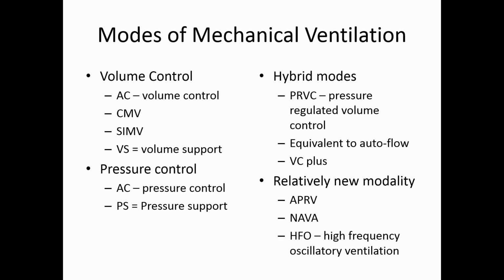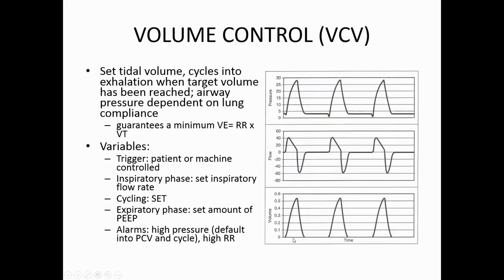So over time, the patient will fatigue. And if they are doing more, they can overcome the volume that you set, and you end up with a much bigger tidal volume than you want the patient to get. I'll talk a bit about this tomorrow.